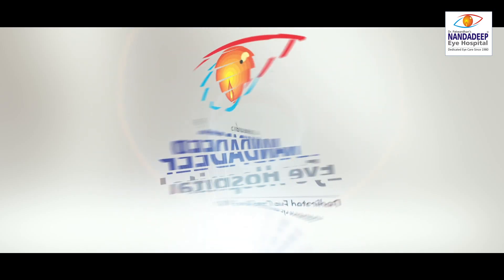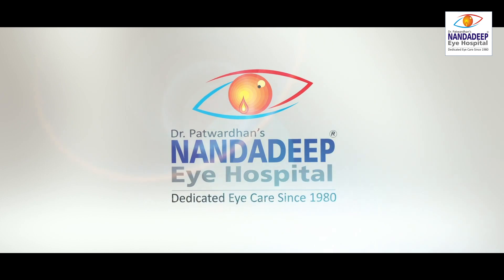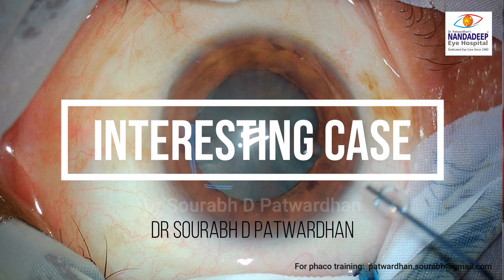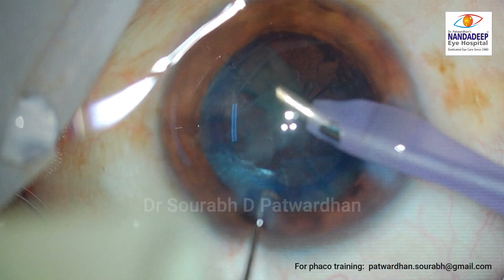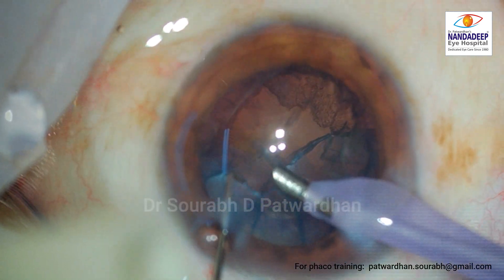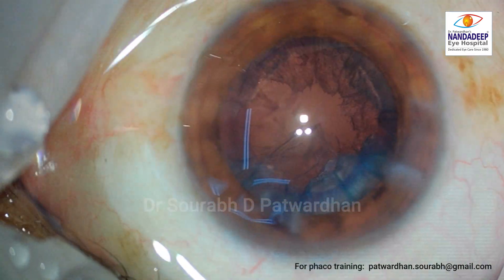Hello, I am Dr. Saurabh Patvardhan from Nandadeep Eye Hospital and in this video I will be discussing a very interesting case of trifocal IOL. The cataract is a routine cataract. I have already implanted the trifocal IOL in the other eye of the patient.